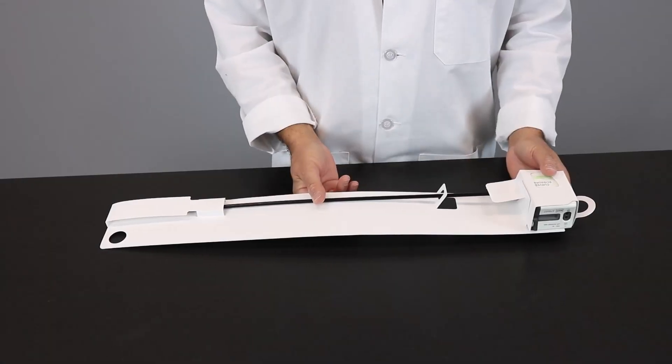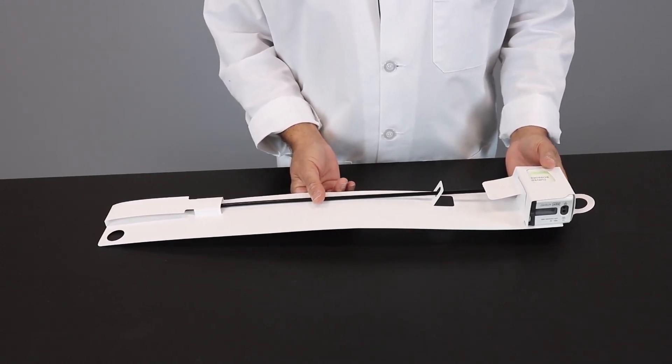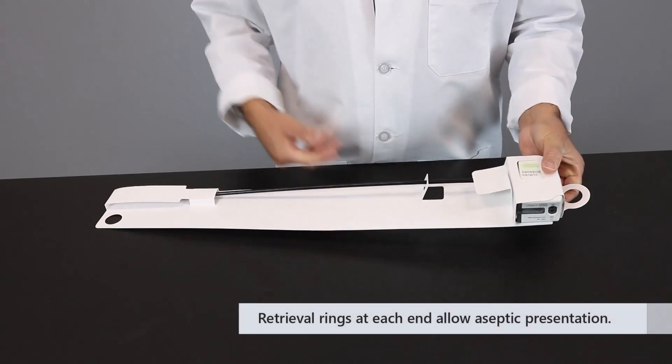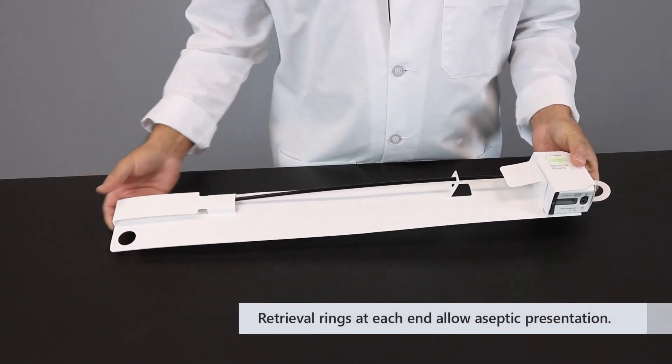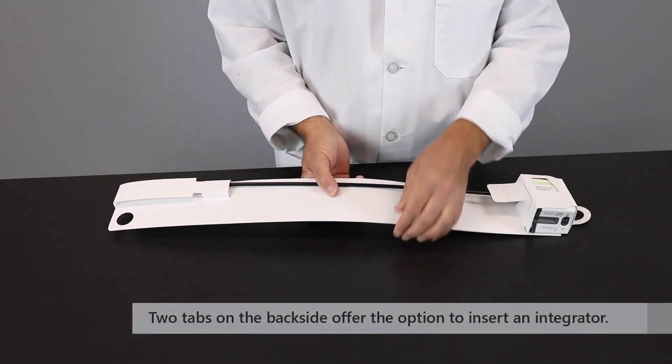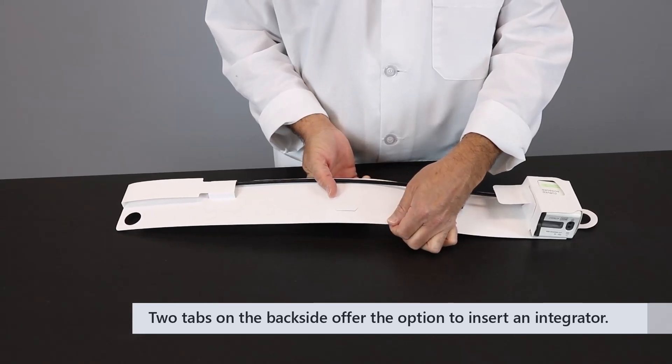Now that we've assembled the robotic instrument protector card, I want to mention a few features. The first one is the retrieval ring on the proximal end here, as well as the distal end here, which is used for aseptic presentation. I also want to show you this feature on the bottom where you can see two tabs where you place an integrator.